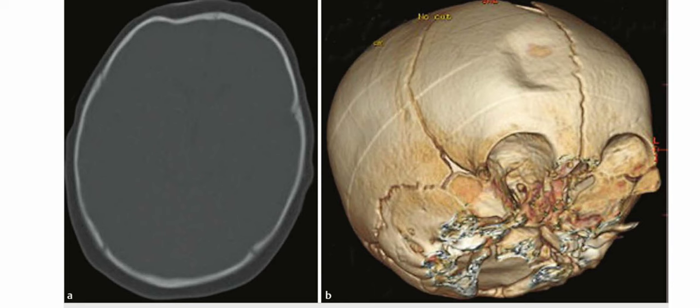These are images of a 6-month-old girl presenting with head injury. The axial CT scan in bone window shows a concave deformity of the frontal bone on the right side with no intracranial injury. The 3D volume reformatted CT scan shows the deformity adjacent to the metopic suture, which mimics a dented ping-pong ball. The key finding is a concave skull deformity in an infant and this is a ping-pong fracture — a specific depressed skull fracture in infants resulting in a concave deformity.